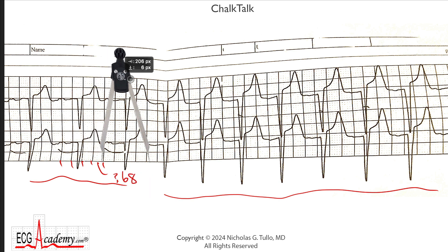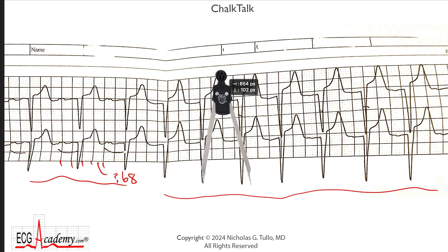But dragging the caliper over to this side, we can see that these QRSs are a bit faster. Resize the caliper, take it to the grid, it's more like about 90 beats per minute. So there's clearly a change in rate and a slight change in the morphology. The one on the right side seems a bit deeper, a bit wider perhaps.